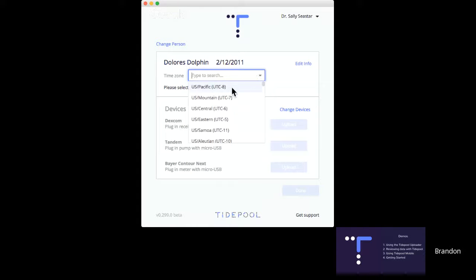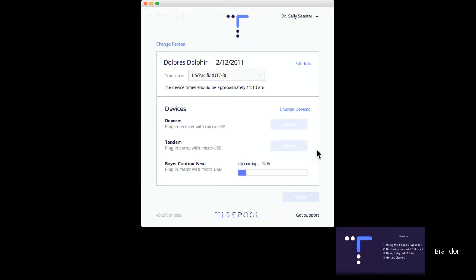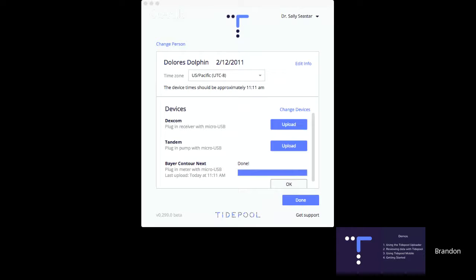Finally, we set the time zone. This allows Tidepool to read the device on the correct time and actually go back and fix any time gaps caused by daylight savings or travel. I'll do a quick demo and upload a Bayer Contour Next meter. Device upload times do vary. Now that we've created Dolores' account, it is there forever — the profile information is saved and it will be there the next time you want to log in and upload for Dolores. Now I'm going to switch over to the Tidepool web view, which is where you'll be viewing Dolores' data.